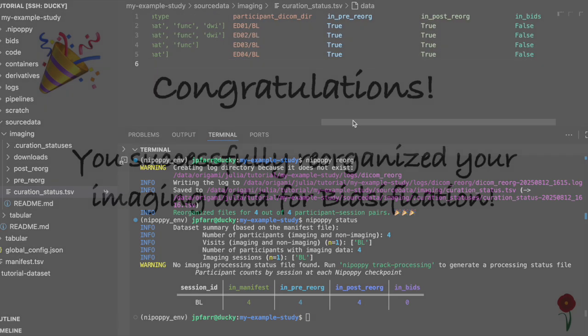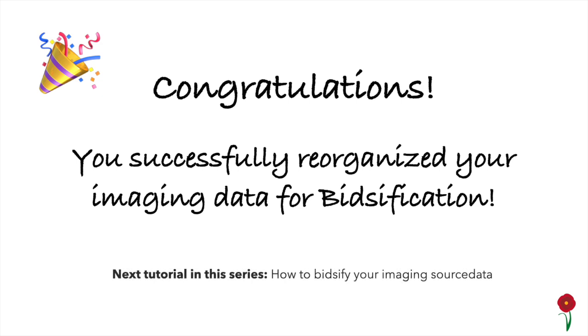Congratulations! You are now ready to BIDSify your data.